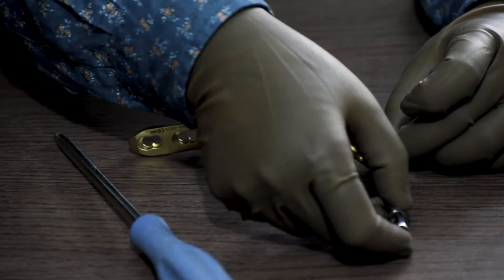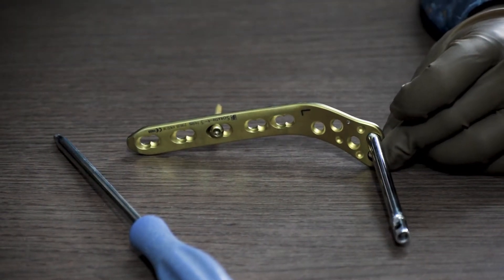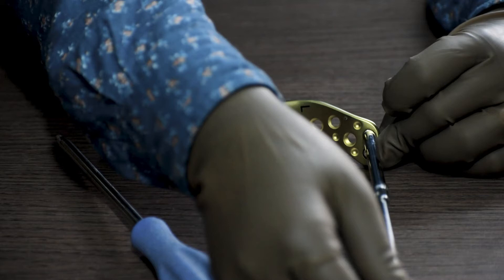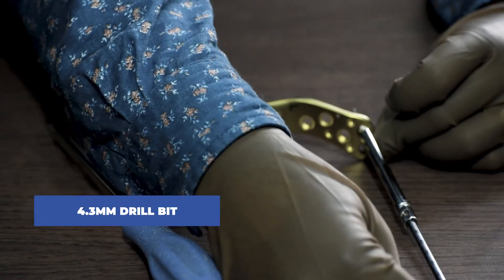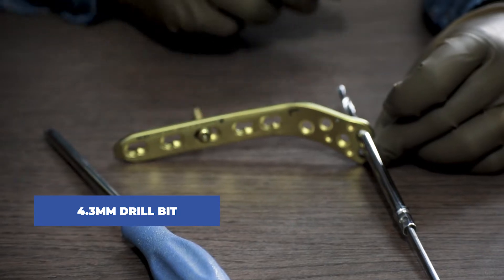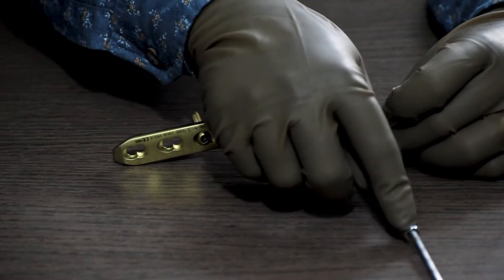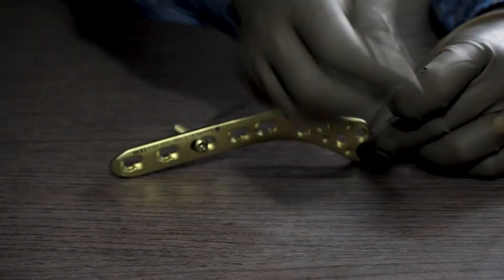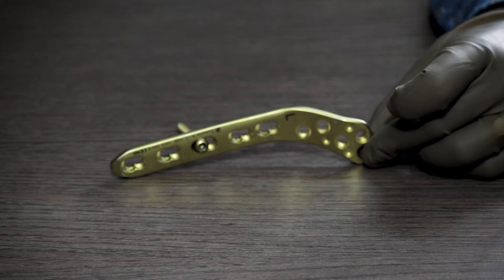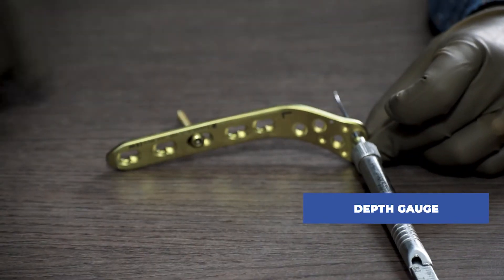After fixing the locking sleeve, we will drill using a 4.3mm drill bit through the locking sleeve. For some companies there is a scale already printed on the drill bit, which allows you to take the measurement of the screw length required. If not, we remove the 4.9mm locking sleeve and take the measurement with the help of the depth gauge.